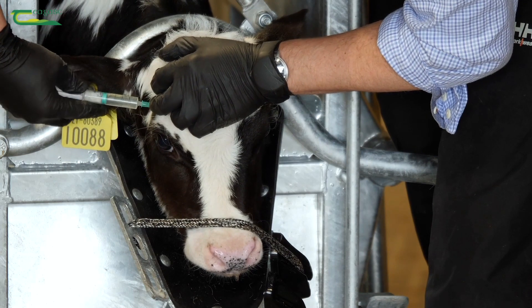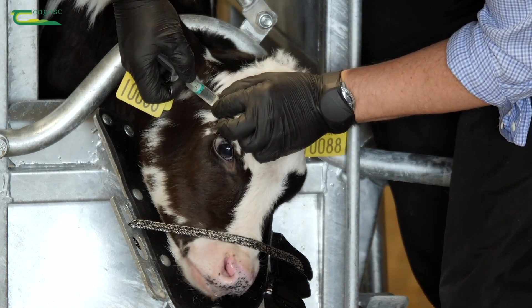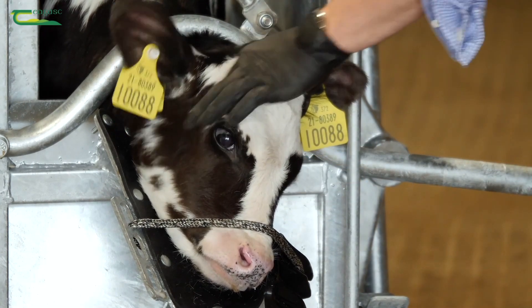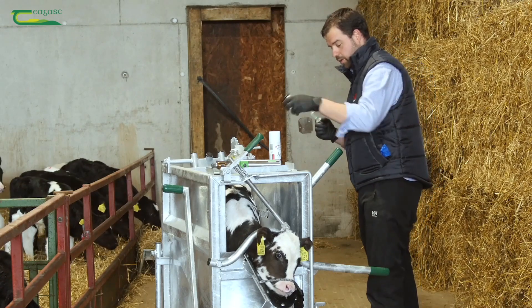Gently inject that. Now draw back on the plunger to make sure that there is no blood, and then you can gently inject this calf four to five mls. Now obviously that's only one side done, so you want to do the other side for de-budding both sides.